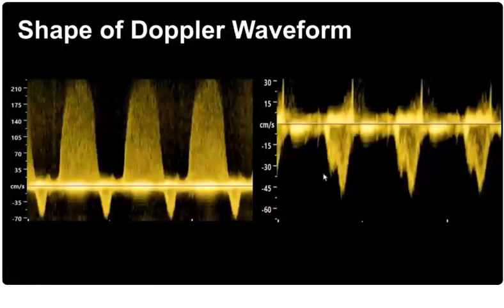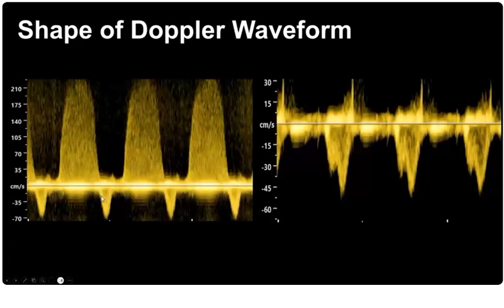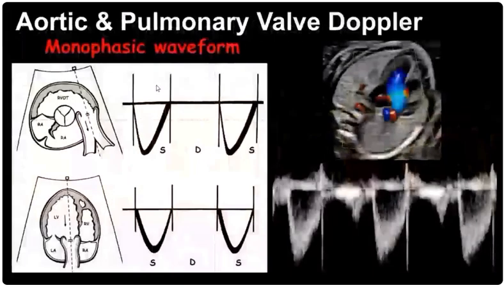What we are really looking at, and what is considered pathologic, is when the filling of the ventricles is very short and we can see only one phase, also called monophasic filling. And of course, in systole, we can see significant backflow across the valve, that's called tricuspid or mitral regurgitation. And these are the typical changes that we usually see on the spectral Doppler.